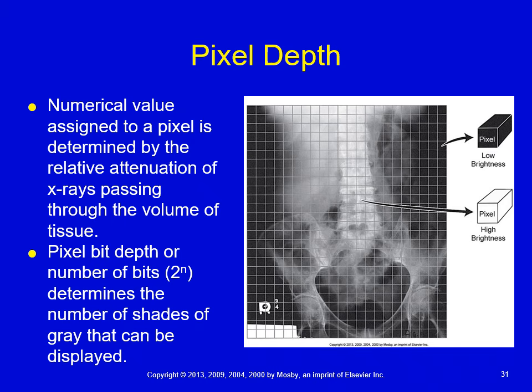All right, another example: let's say we have an 8-bit image, or a machine that was capable of 8 bits. We would replace the n with 8, 2 to the 8th. If you take a moment to calculate it, or you can just use your smart calculator, that should come to 256. So we're talking about 256 possible shades of gray.